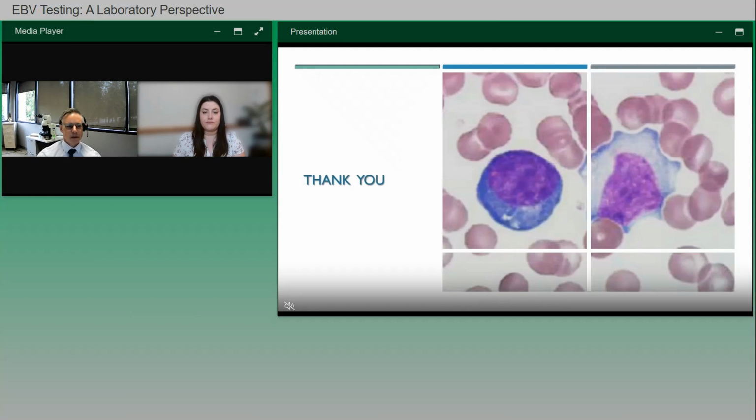Yeah, I think I probably just answered this a couple questions ago, for the solid organ transplant question, where they definitely do PCR repetitively to monitor those viral loads over time to see if they're decreasing.